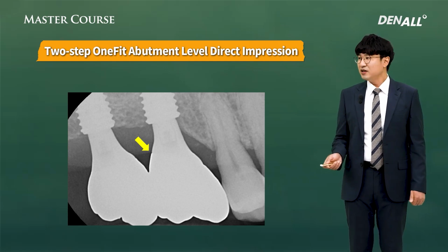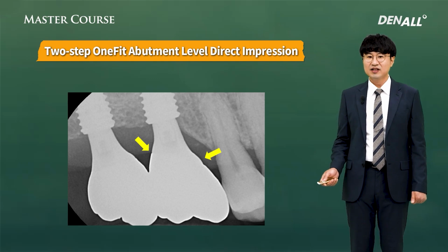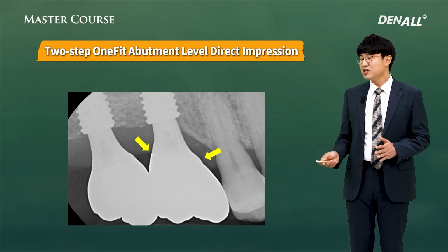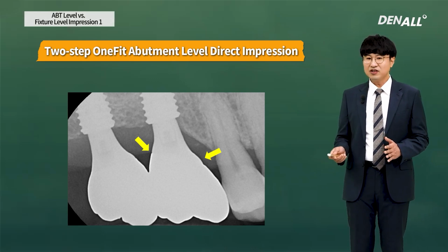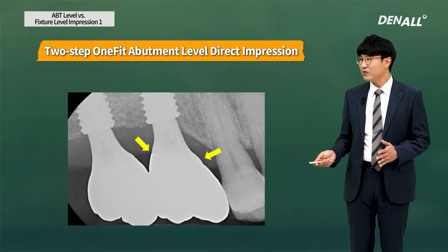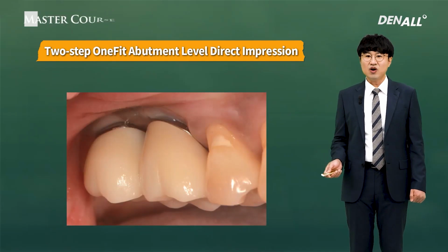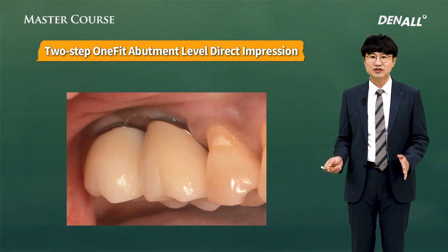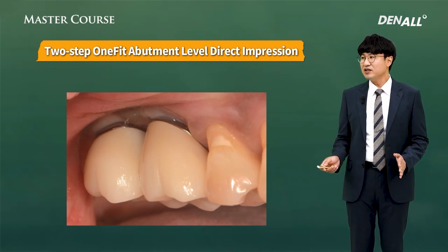And here, there could be some wiggle shape or a dent. This is because the abutment and the prosthesis are created separately, as the space allocation would not be perfect, so the shape might not be complete, and this type of dent is often seen. And also, if the abutment and crown are not created at the same time, another disadvantage is that shape-wise it might not be perfect.